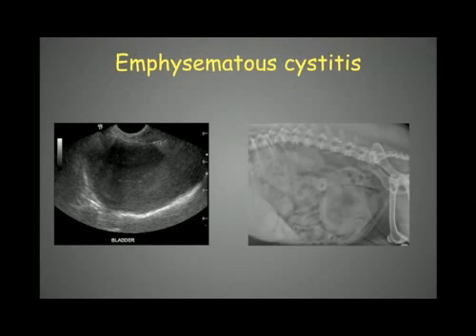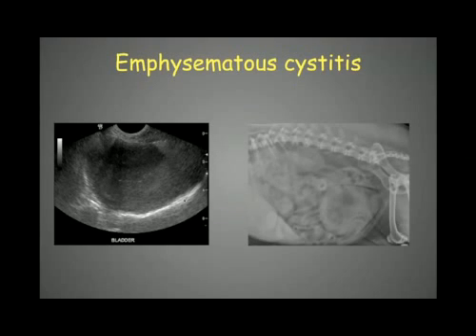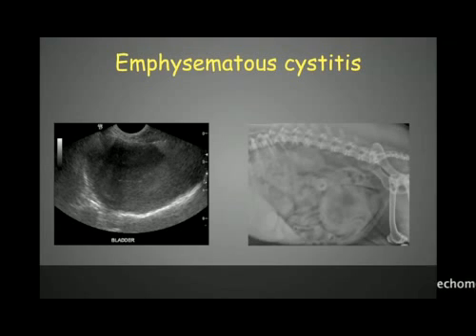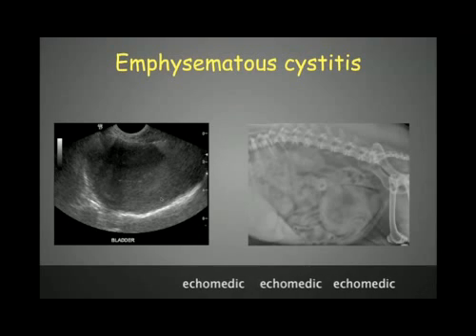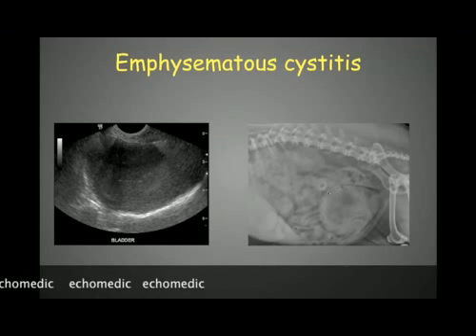Here is another example of emphysematocystitis with gas within the wall of the bladder. If the gas were free in the lumen, it should rise to the non-dependent side. Here it is staying along the dorsal wall, which means the gas is within the wall itself, as we can see on this radiograph.